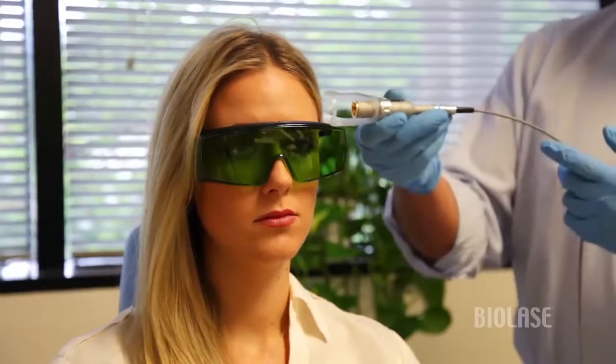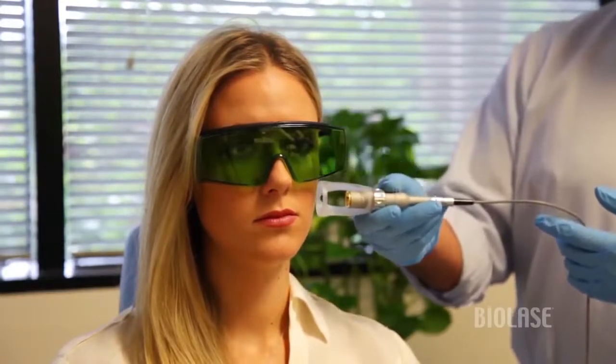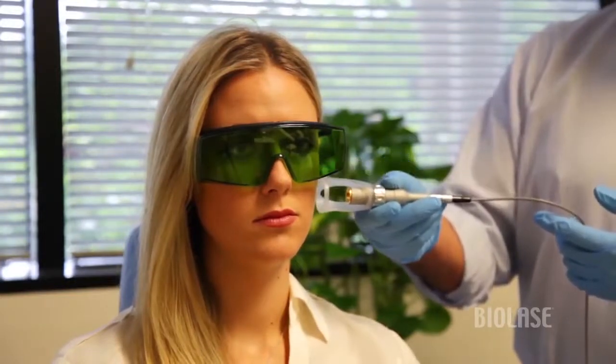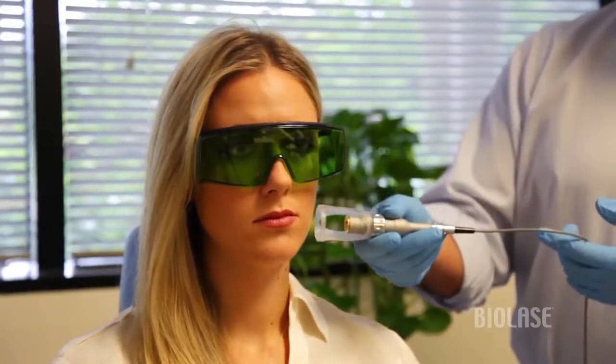As we move through the three different areas, we need to keep in mind that in some patients with darker skin or darker hair, those will absorb this laser energy, because this is a dark-seeking pigment laser.